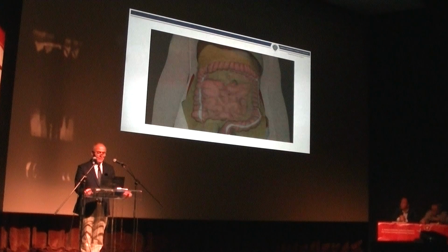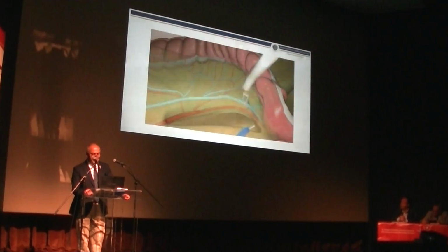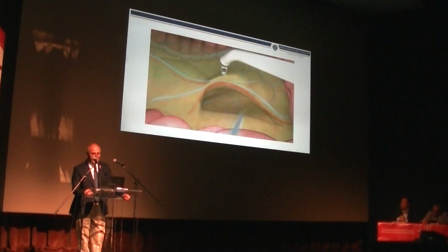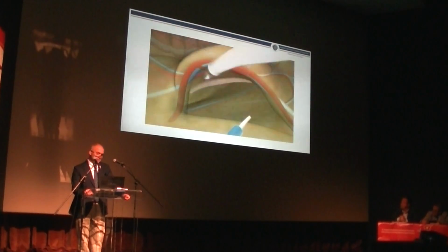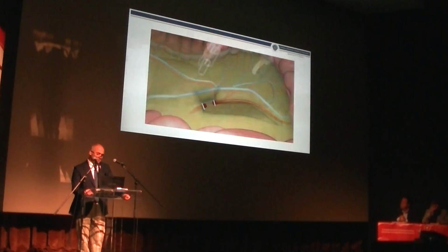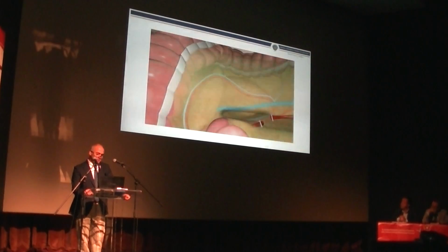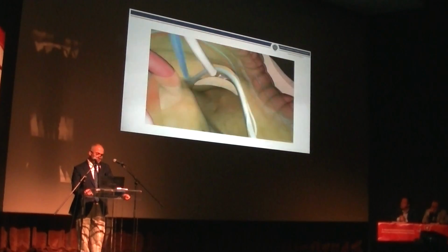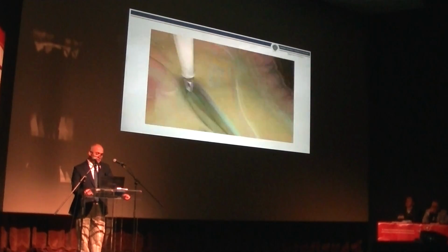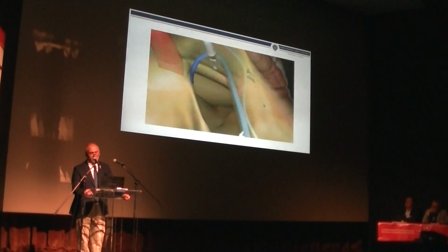And here, what I have learned from Amjad, I must say, is the way we do splenic flexure mobilization. This is the animation showing it, and it's good for the residents and our senior registrars to follow it beforehand. It shows and delineates the anatomical structures. This is the inferior mesenteric vein, and we are taking down the inferior mesenteric vein next to the duodenojejunal junction and the inferior border of the pancreas.